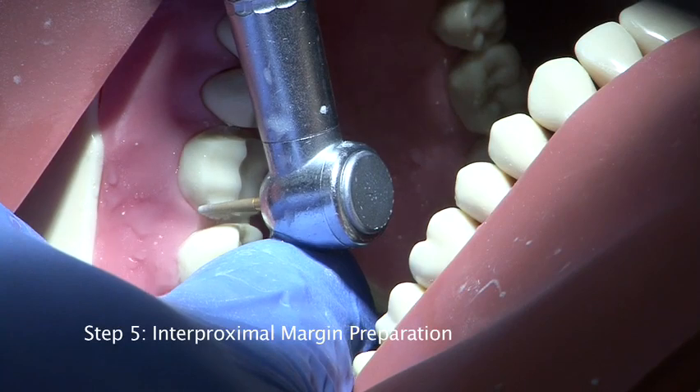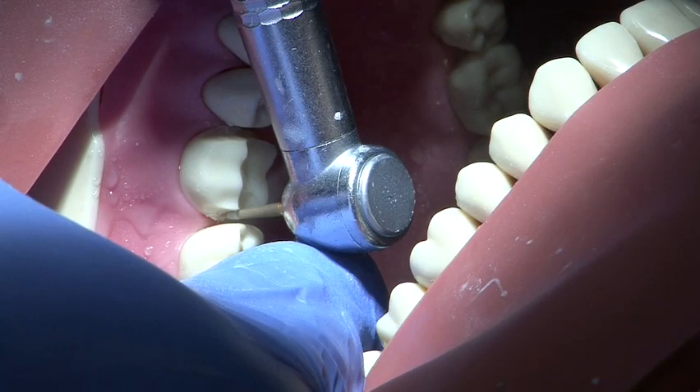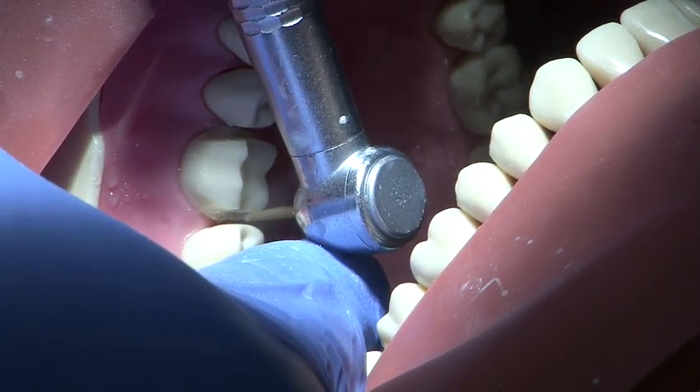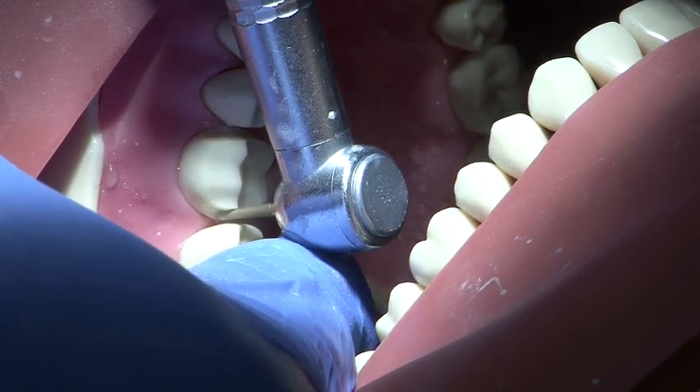The interproximal margin is then prepared to a 0.5 to 1 millimetre chamfer using a parallel sided medium grit round end burr. A smooth action is employed and the handpiece is supported with the free hand at all times.